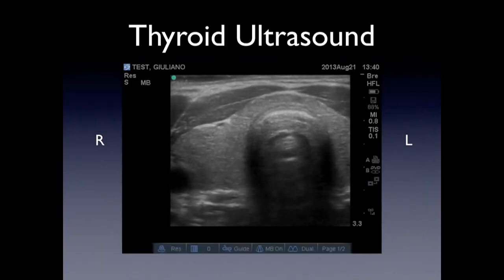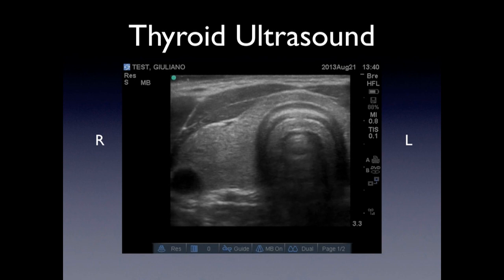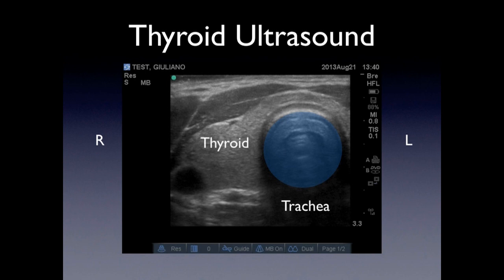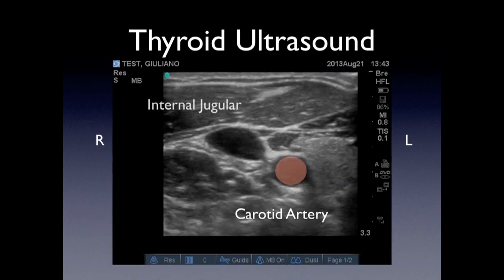This is a moving image of that transverse view. You're going to be able to see the trachea again, the right lobe of the thyroid, and you're also going to see the common carotid artery. If you move the transducer laterally, you're also going to be able to visualize the internal jugular vein. The internal jugular lies lateral and anterior to the carotid artery.